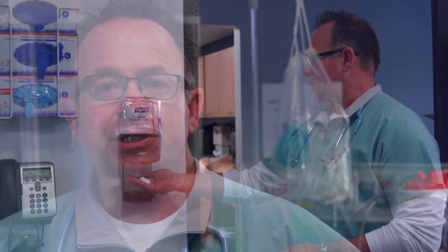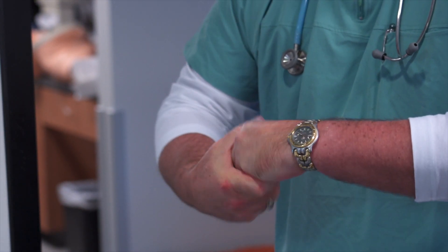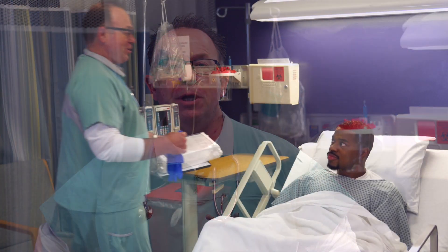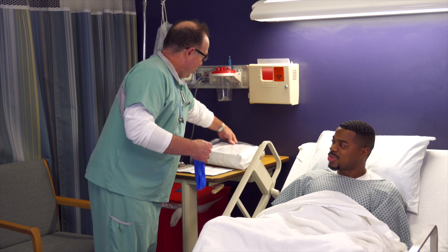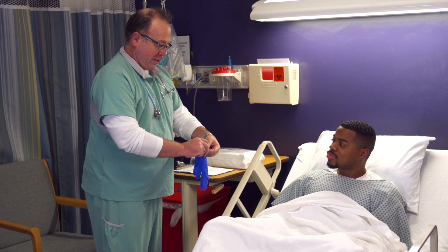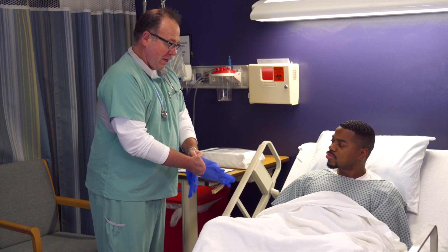In this segment, we will demonstrate cleansing the perineal area with swab sticks. Perform hand hygiene immediately before and after insertion or any manipulation of the catheter device or site. Begin by gathering your supplies. You will need a Foley catheter closed system tray, perineal cleansing supplies in accordance with your facility's policy and procedure, and additional cleaning gloves.